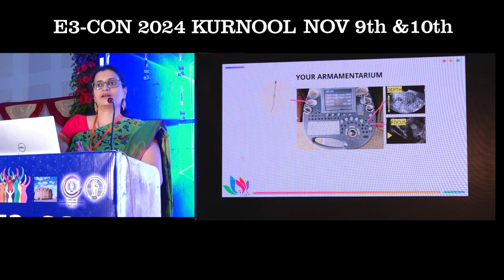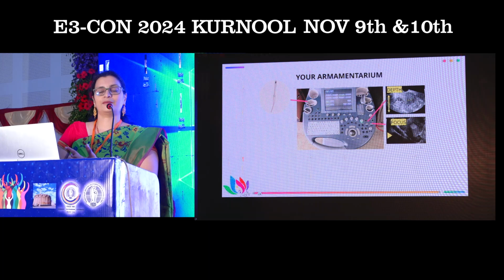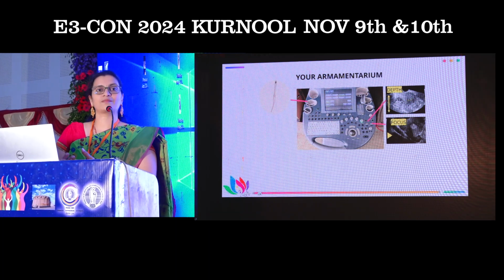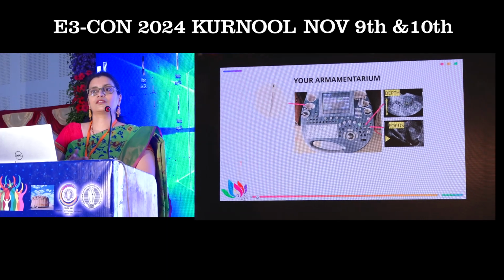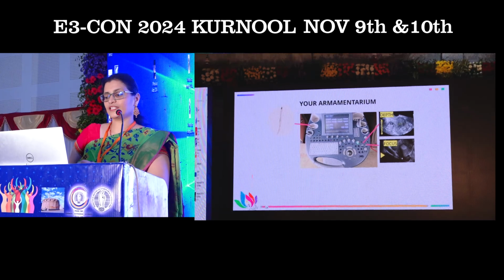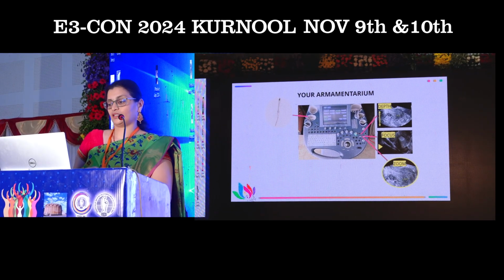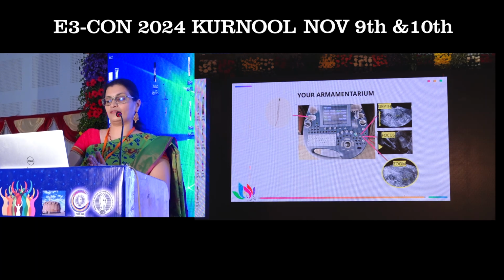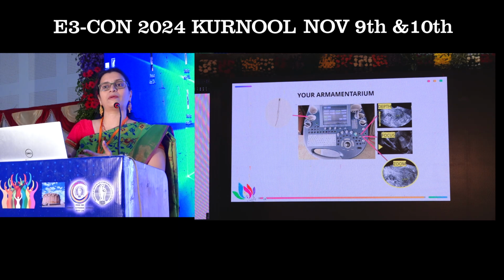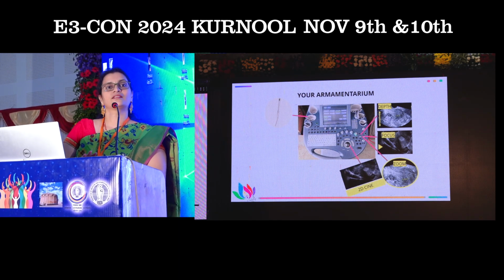That focal point. So whenever you are looking at an organ, suppose I want to look at this ovary here. If my focus is here, it will give a good view of the uterus but not that good of the ovary. So I need to adjust my focal point so that the ovary gets visualized in a better way. Using zoom, when we have adjusted the depth and the focus, we can also use the zoom to increase the magnification of the organ of interest for better evaluation.